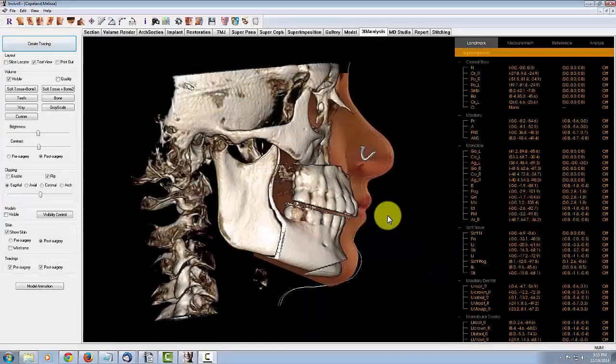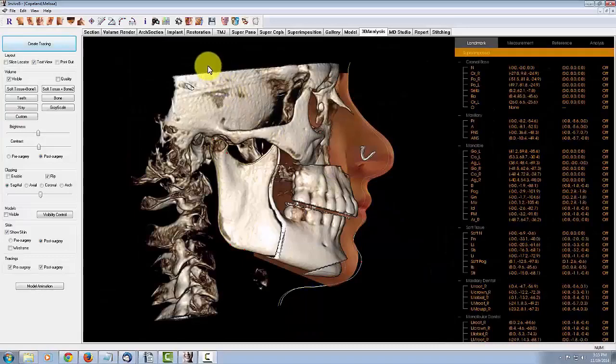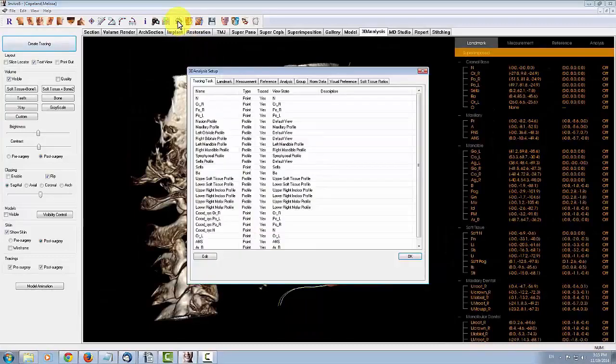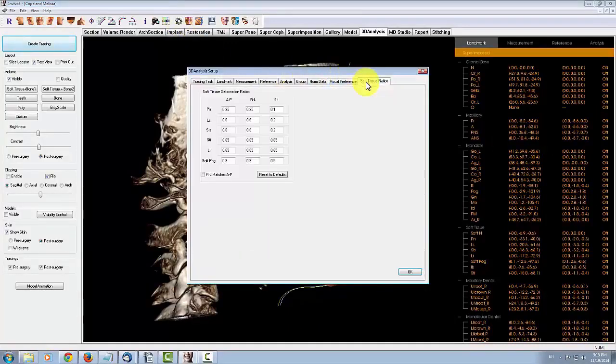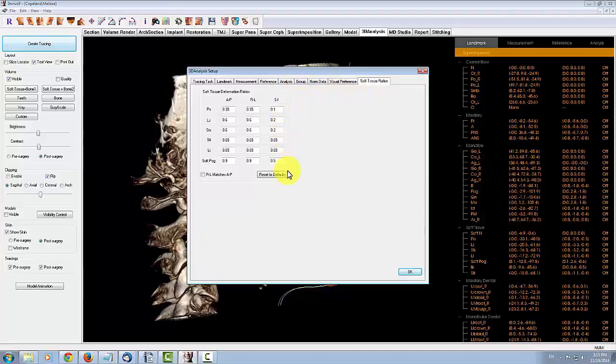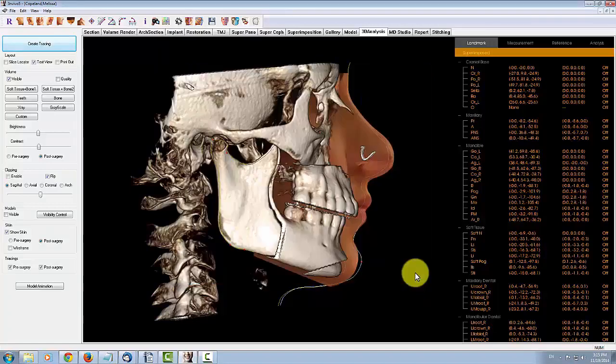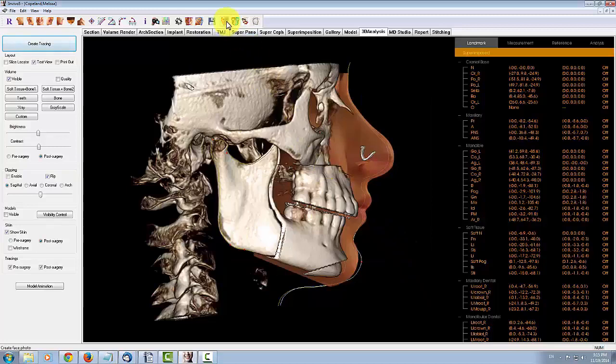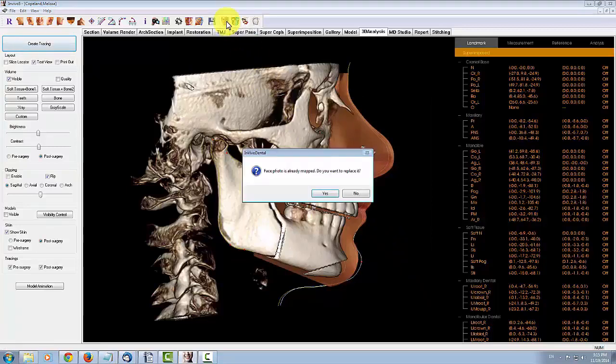To manually set the soft tissue deformation ratios, go to the Preference tool, click on the Soft Tissue Ratios tab, and enter values in the given fields. For skin overlaying, Nvivo 534 now supports 3D camera data in the form of OBJ files.